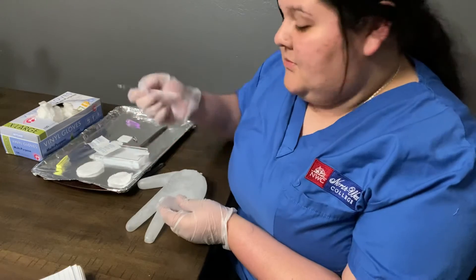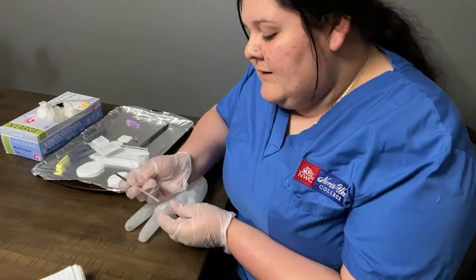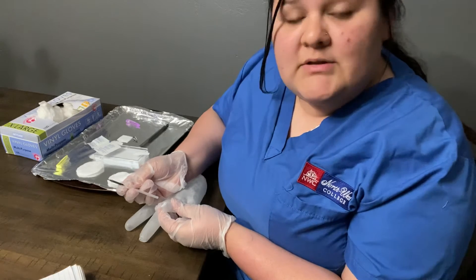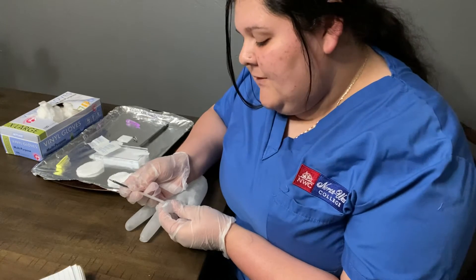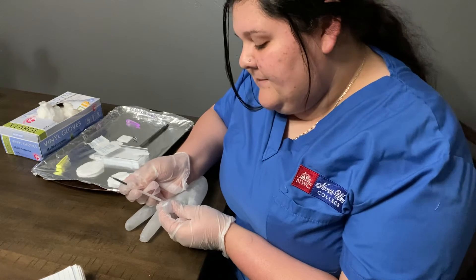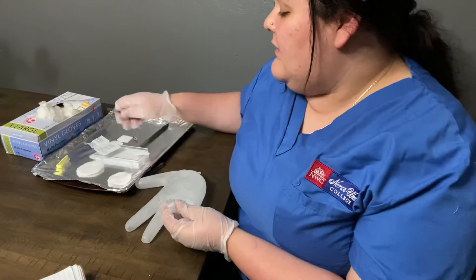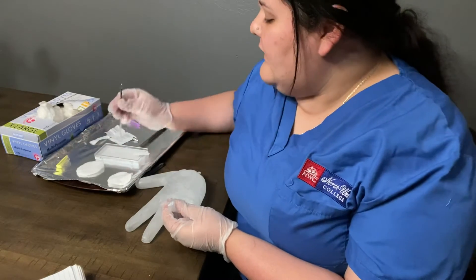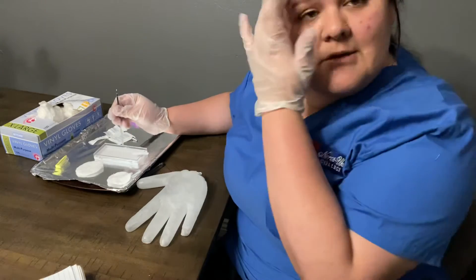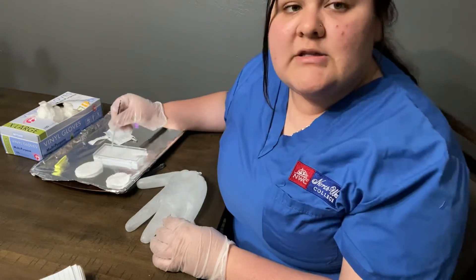Then I'm going to get my capillary tube, which looks like this. You're going to want to hold it down at an angle so you don't get any bubbles inside the capillary tube, and fill it with blood. You're going to want to get two tubes filled. After you do that, you're going to want to poke it into the clay — there's going to be clay right here — and then stick the tube in like this. That's how it's going to look.